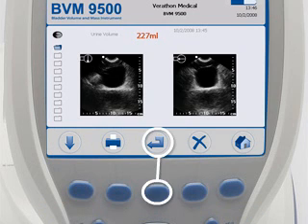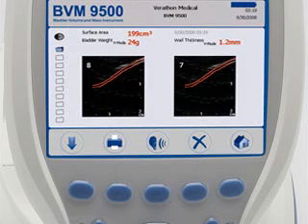Pressing the Return button displays Review Screen 2 with data on UEBW, bladder surface area, and bladder wall thickness. If a manual measurement of bladder wall thickness was taken, that data will be displayed on Review Screen 2 as well.